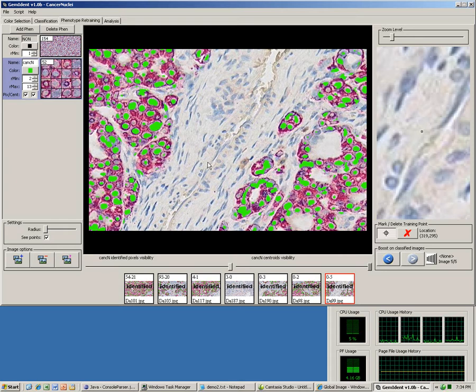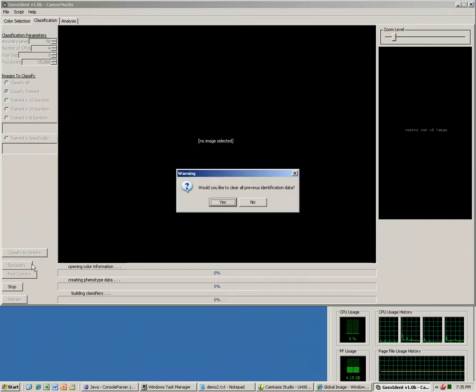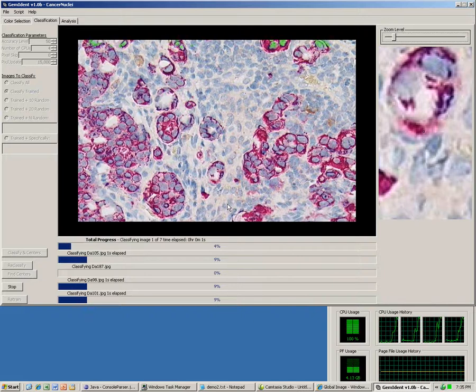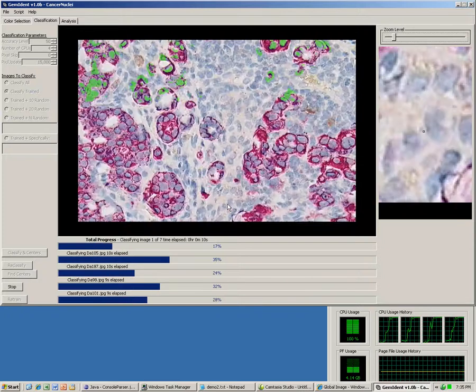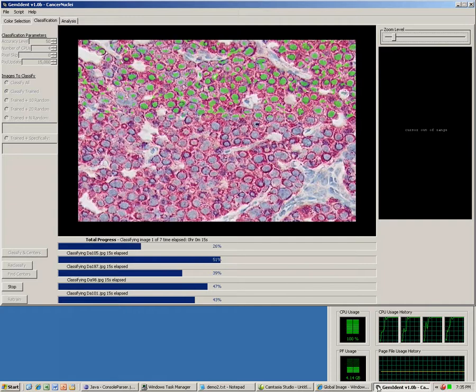It's now time to reclassify. This time we'll allow GemIdent to post-process and find the centers as well. To save time, let's classify only those trained. Notice how GemIdent identification takes a toll on the computer itself.